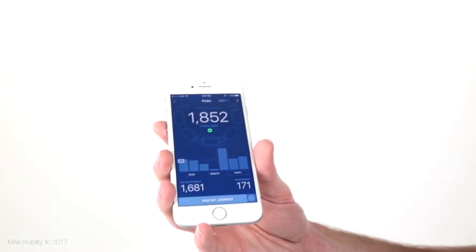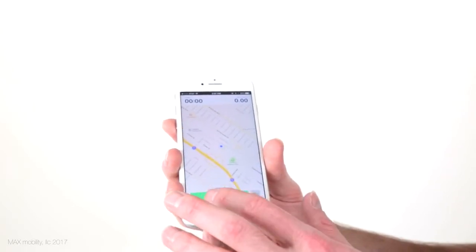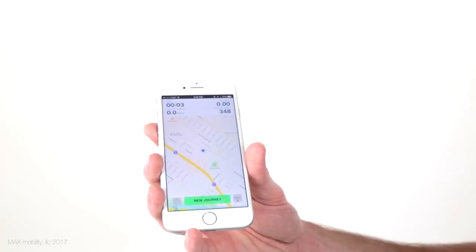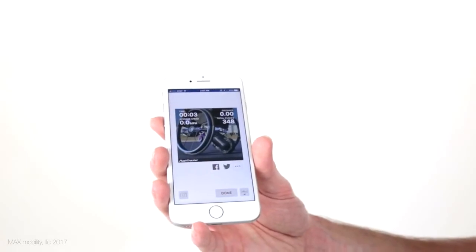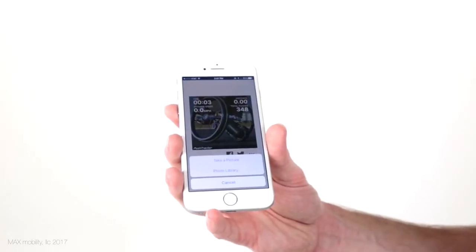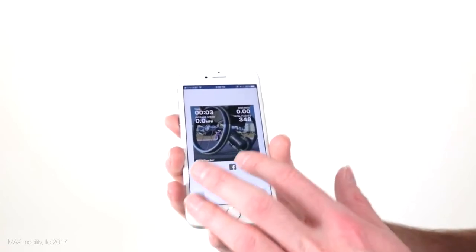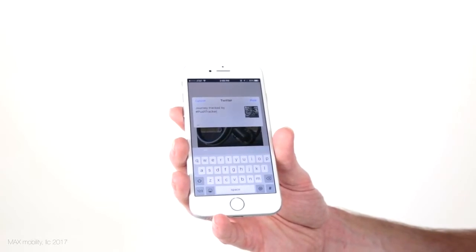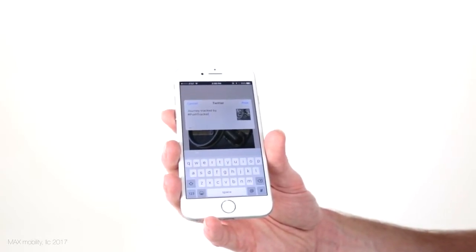And finally, there's the Map My Journey button. With this, you can map out and track the details as you explore outdoors. To do this, just select New Journey, then push your SmartDrive along. When you're done, press the Finish button to see the details of the trip at the top, and also choose to share it on social media. When doing this, you can use our default SmartDrive image, take a selfie where you ended up, or select a photo from your library, then post, tweet, or send for all to see.